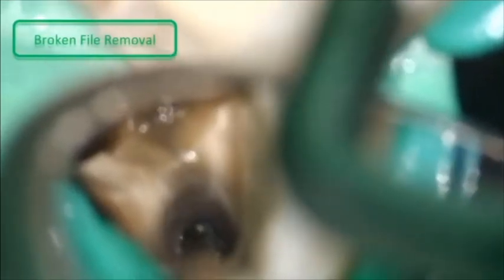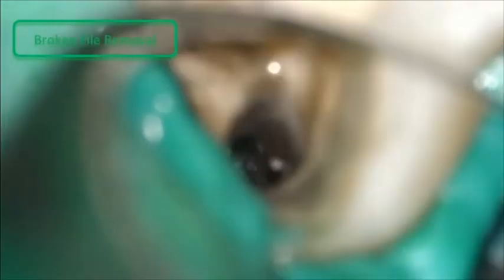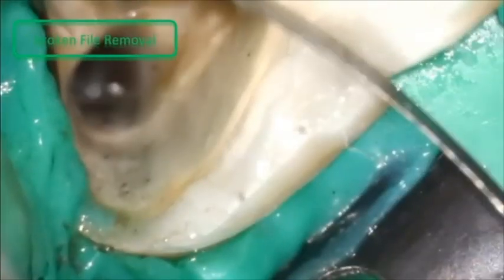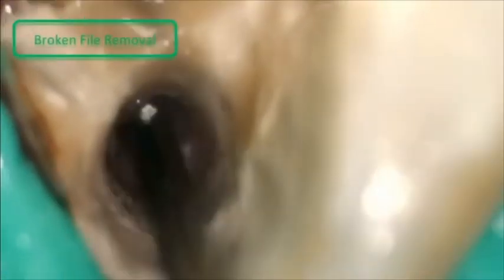Here I switched to the ET25 and it came out with the ultrasonic. I didn't use any kind of grasper or extractor. So it was vibrated, blocked against the wall, and removed from the wall of the canal. It's in the middle third. I'm going to use just a probe, only a probe, to help it find its way out. I'm going to push it out slowly.